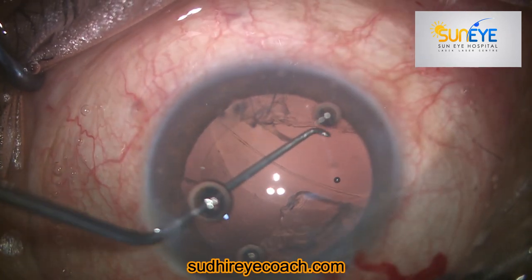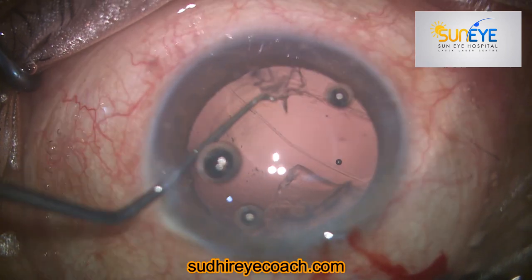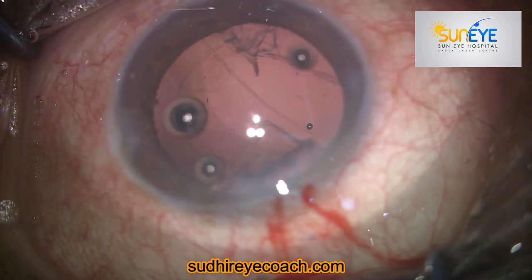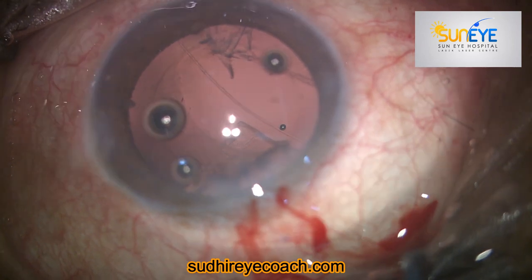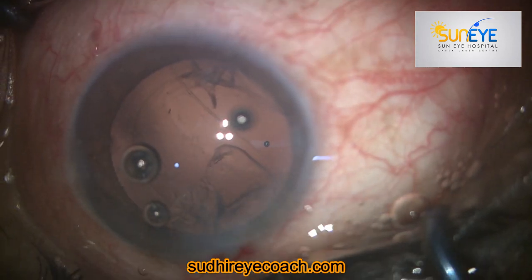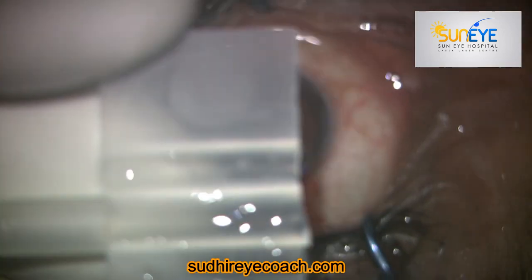With a blunt tip I assessed the amount of tear and started evaluating whether I could put a normal single-piece hydrophobic implant in the bag or not. I then realized the tear was so big that it would probably not be possible to implant a single-piece hydrophobic implant in the bag.